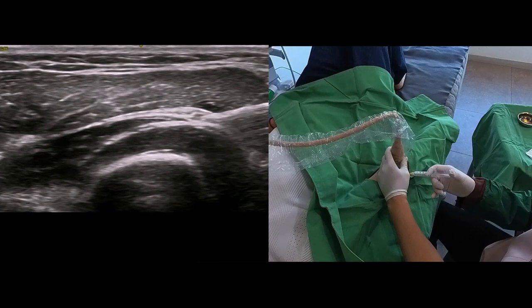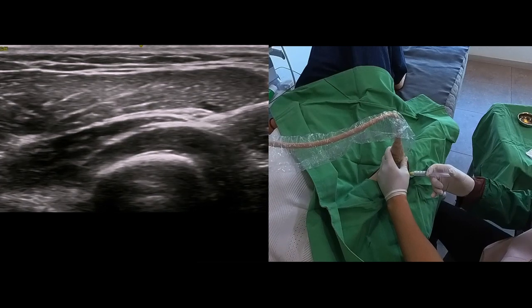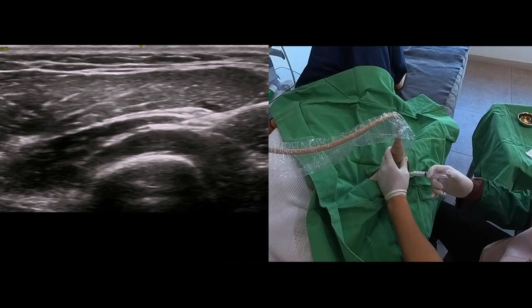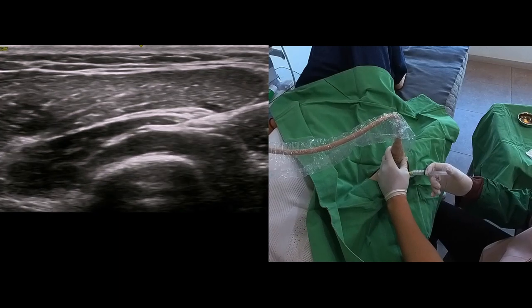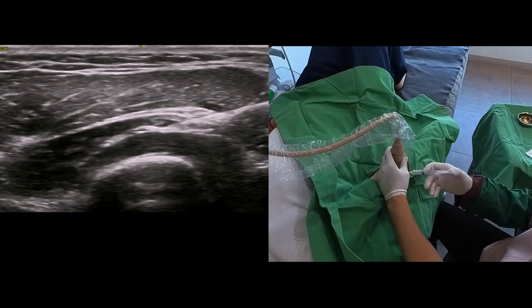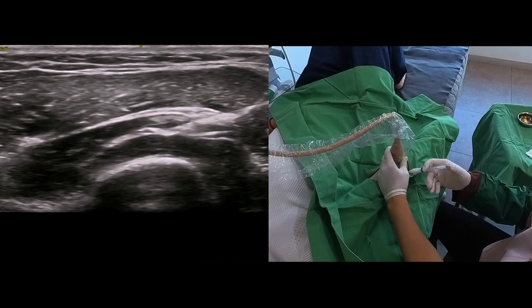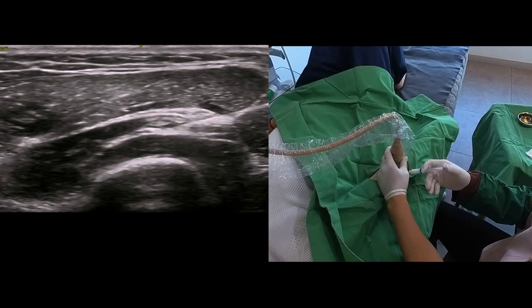I want to ensure that the pathology in this patient is in the middle of the supinator muscle, not in the arcade of Frohse. I would approach more proximal and medially if the pathology is in the arcade of Frohse, and add more hydrodissection between the supinator muscle and the brachioradialis muscle.